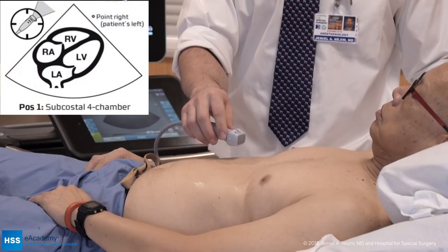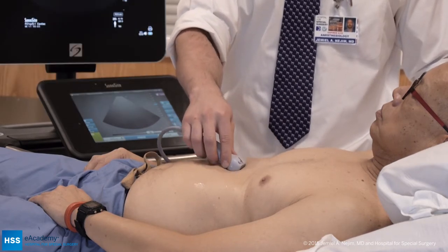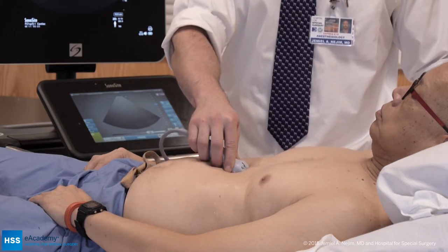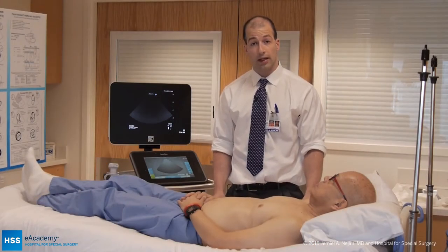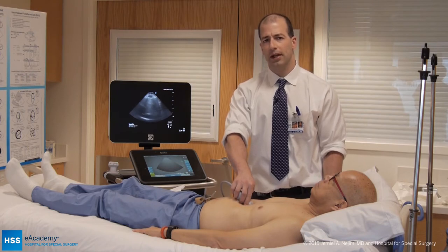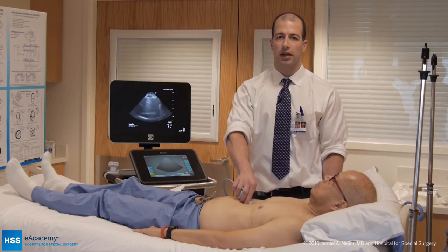The first view is position one, the subcostal view. For this view, I place the transducer under the xiphisternum with the orientation marker towards the left. Notice I hold the probe with my palm above the probe, not below. For position one, the ideal position is the patient in the supine position. If you're having trouble obtaining an image, you can have the patient take a big deep breath and then release it slowly. You can also try rotating the probe counterclockwise by about 10 degrees.